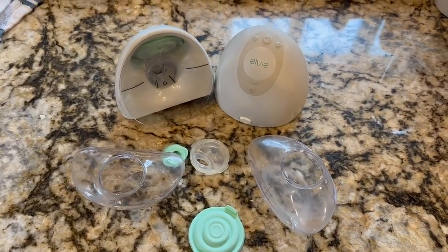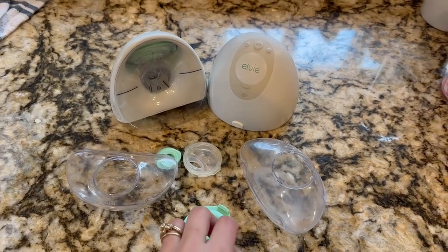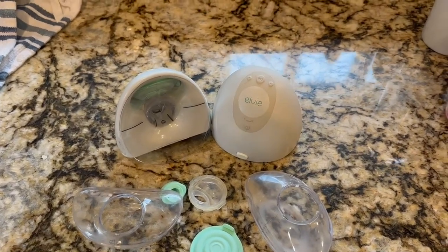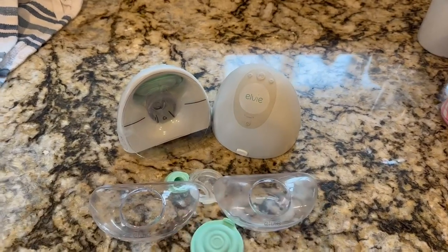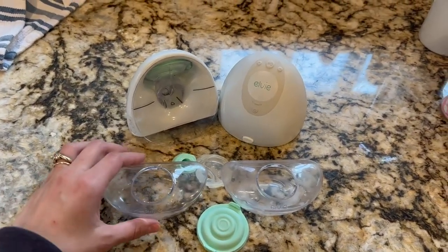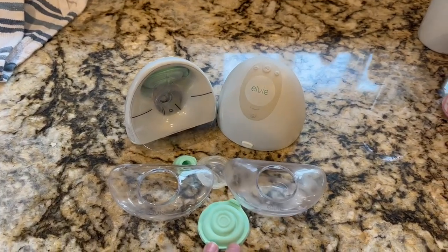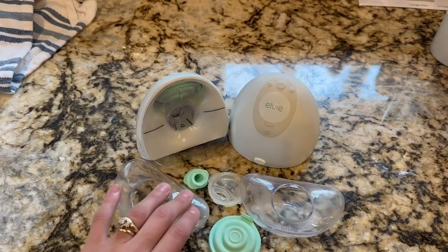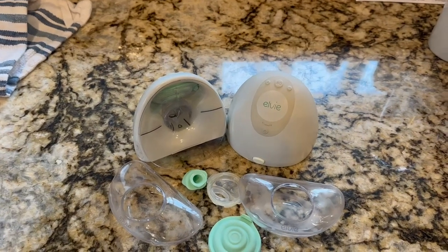Here I have the LV double wearable breast pump, and this breast pump is very easy to use, which is fabulous. It fits nicely — these little cups each hold, they say, five ounces. I have yet to be able to put more than maybe four in them, so that's kind of a tricky thing. I'm not sure exactly why that is.